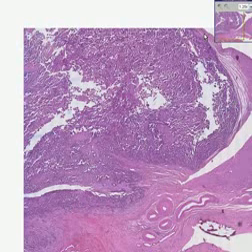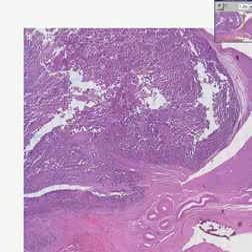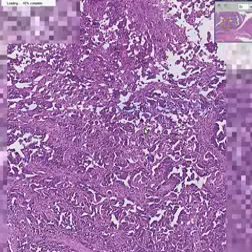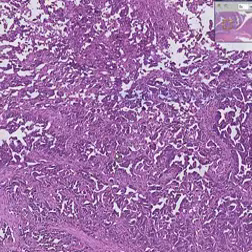appears to be fairly well encapsulated here, but appears to invade into the fibrous tissue here. This is an adenocarcinoma of the ovary. It has a classical appearance of any other adenocarcinoma. In areas, it looks like it's forming little glands. In some areas, it may almost look like it's a little bit papillary. You can see that these nests of cells are invasive into fibrous tissue.